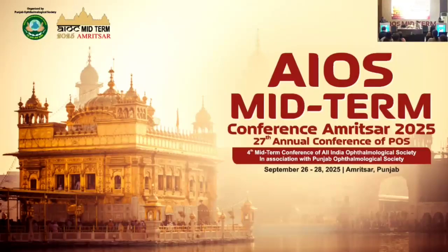So this is the talk I am giving, because early identification is very important. No one diagnosed or referred it. We had a patient who was an IB officer, he was having 6/30, not able to detect the vision. So for the younger generation, you must do OCT, and if there is a macular detachment, you must look for the pit and refer the patient as early as possible, or follow up in your clinic till the NSD occurs and vision falls and the patient agrees for the surgery.